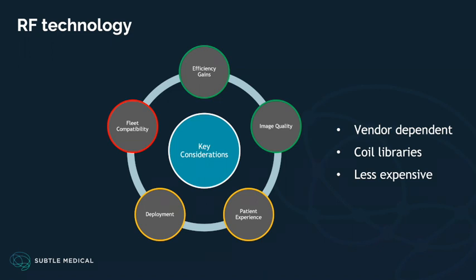So all three of these hardware technologies are extremely important to make an MR system function as optimally as possible. However, looking into the future, trying to upgrade using some of these hardware solutions has to give an extremely high ROI for institutions to go ahead and institute these kinds of upgrades.